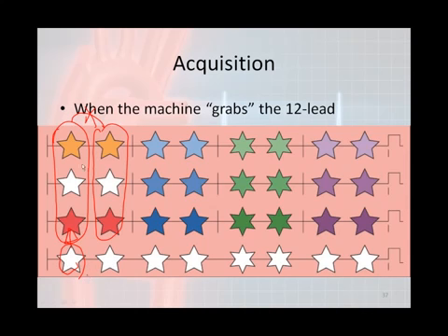This is lead 2, because here's your lead 2, and the white stars are going to be lead 2 printing. Now what you actually have is every single complex above that one correlates, all of these correlate with each other, all of these correlate with each other, so do these as well, and these as well. All of those correlate above, but you have no correlation between those right there. None of these actually correlate at all. This is the temporal relationship.